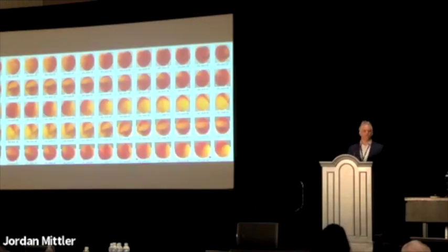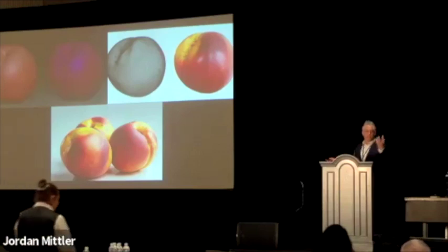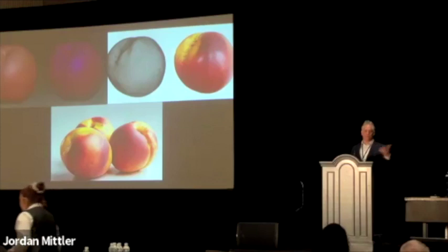You put them into software, and the software takes those images and, through what they call triangulation and whatnot, takes data. On the right side here is the digital file of that original piece of fruit. Now it's a 3D image, and I can copy and paste it like any other file.